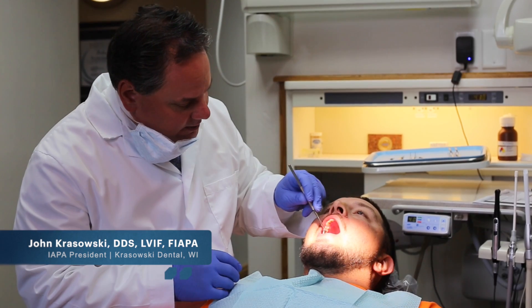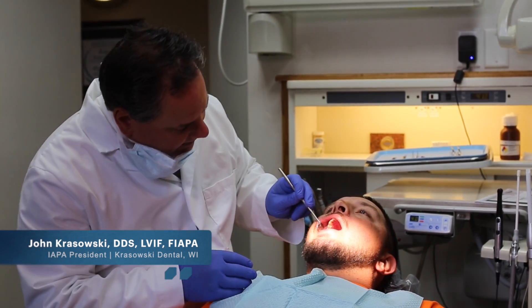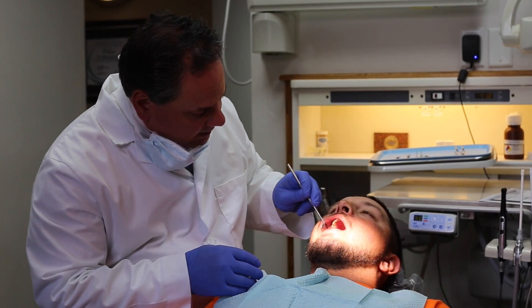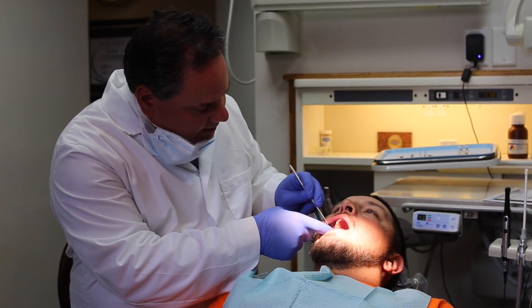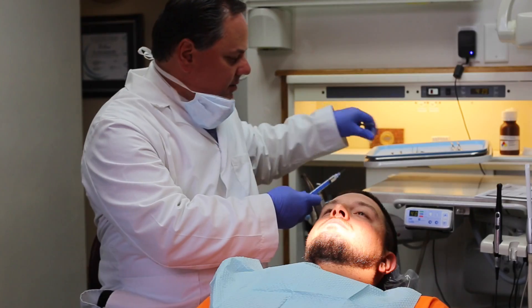Today we're going to be working on that tooth where you had the cavity last time and we cleaned it all up. What we're going to do is get it all numbed up — comfortably numb — and then we'll proceed to clean it all up. Susanna, can we get one?